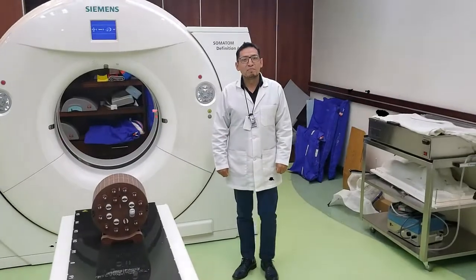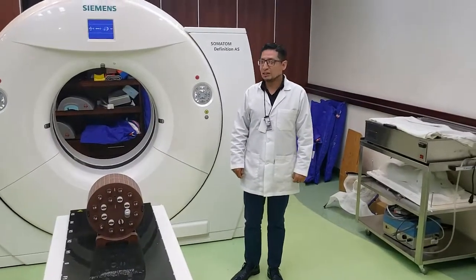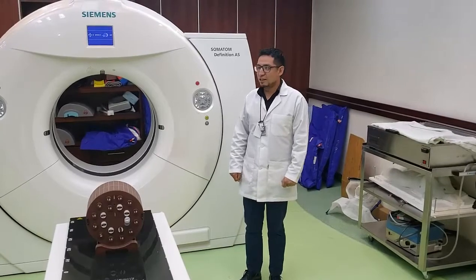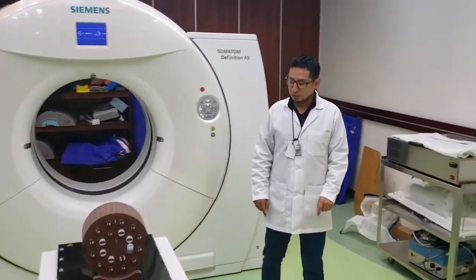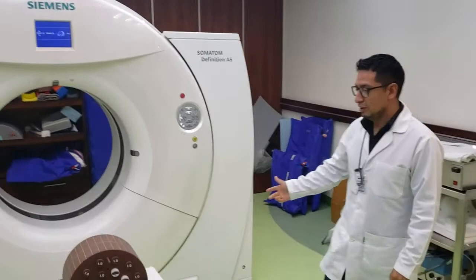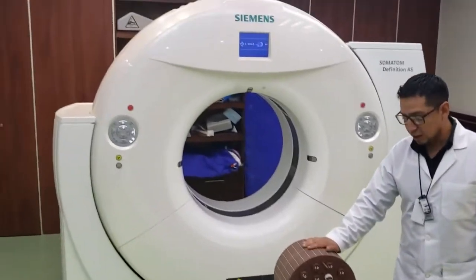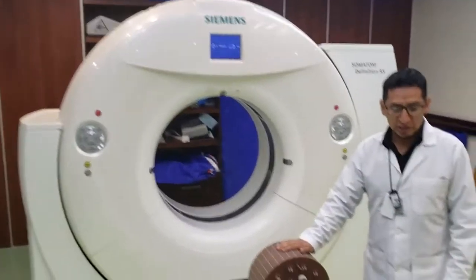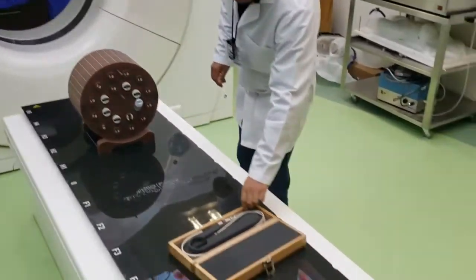Simulation. We are in the simulation area and going to start with the first process, simulation. We are going to use the tomograph, tomophantom — which is our patient — and the ionization chamber.